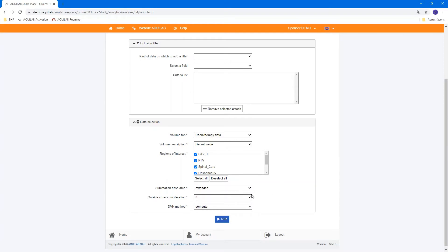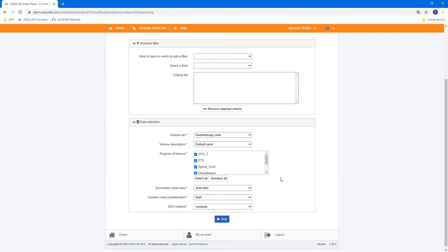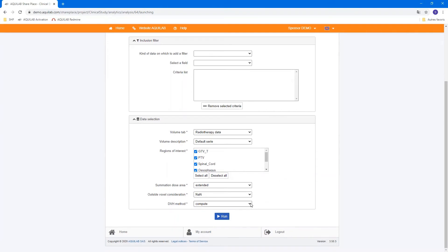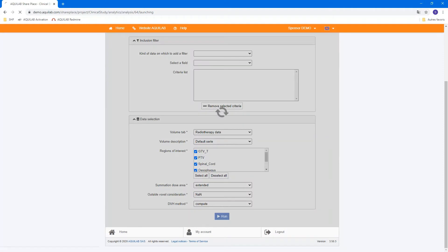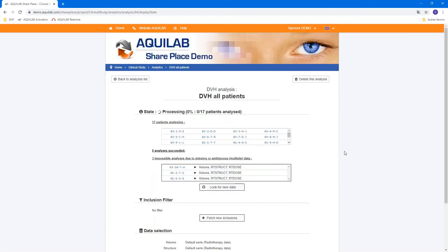You have the choice to have extended summation dose or a common one. We can get extended. And if you want to consider a voxel outside the field or not, we can consider it. And you have two methods for DVH calculation. You compute or read it. Here we can compute and run.